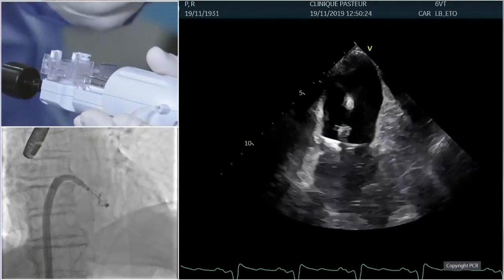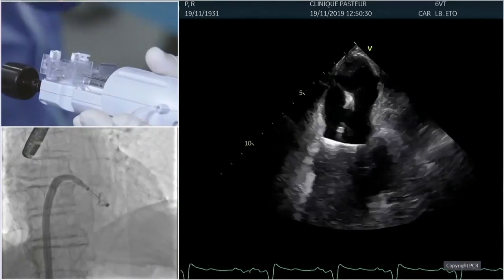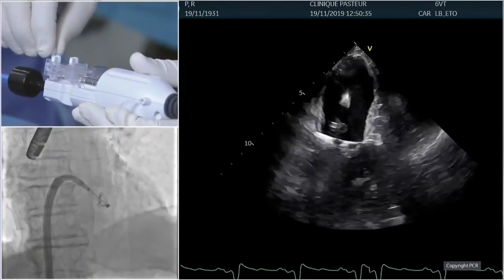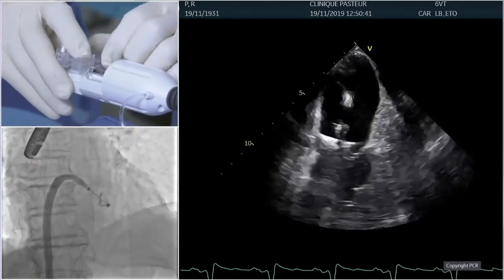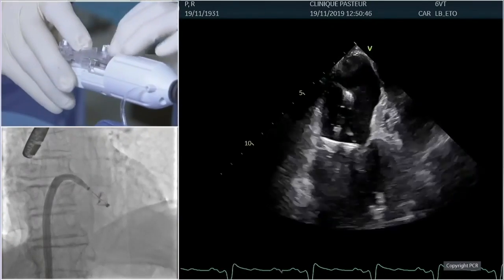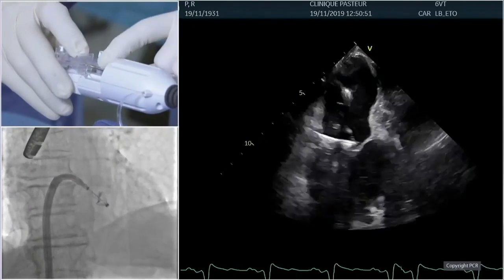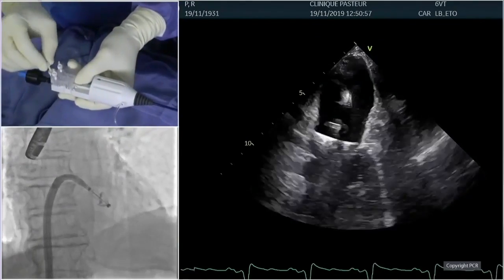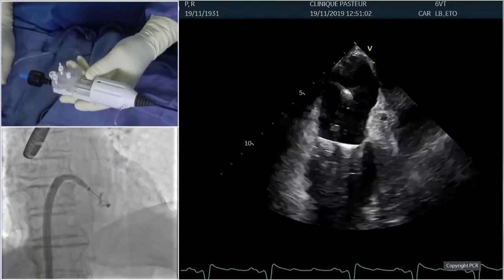sliders, and I have, as operator, to understand which one is controlling the anterior or the posterior. So, keeping the same projection, what I'm going to do is to maneuver only one for us to understand who is the posterior and who is the anterior. So here is this one, and you see the anterior valve side. So I know that this slider controls the anterior clasp. And this is really one of the beauties of this system. It's differential capturing, and in some very complex situations with high tethering, it's really useful.